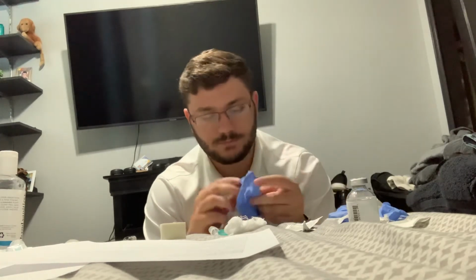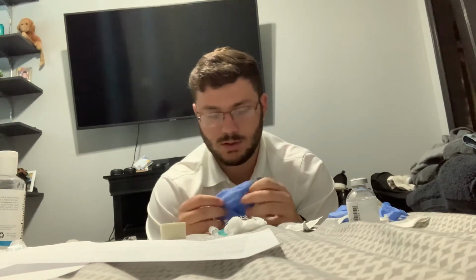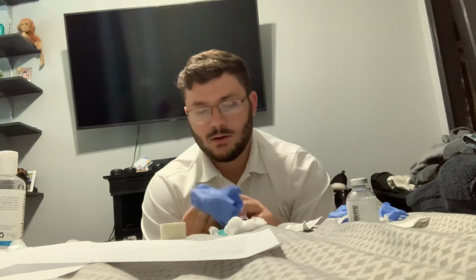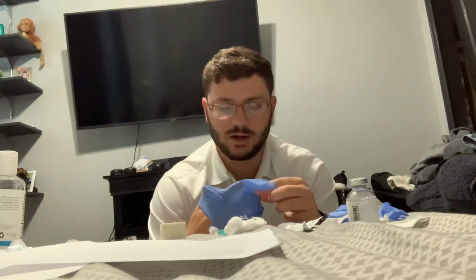So yeah, we have identified landmarks and we can palpate for proper area. So I palpated that the deltoid is probably the best area to administer this medication. So in doing so, I am now going to don gloves, and then we're going to do our 3rd check.